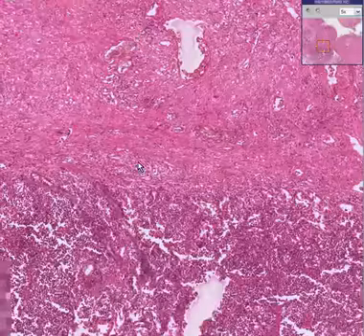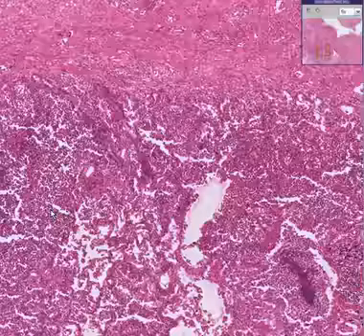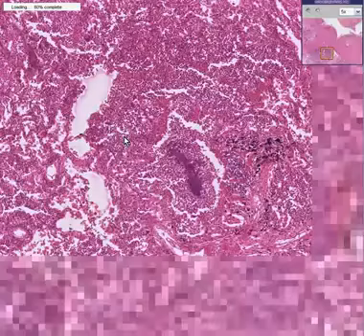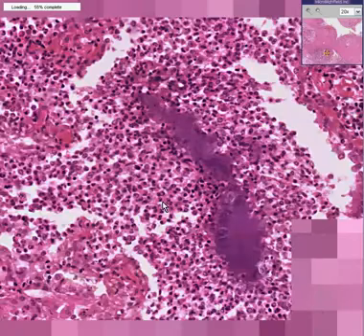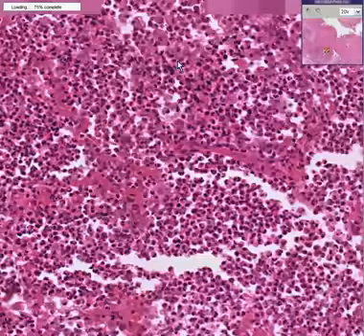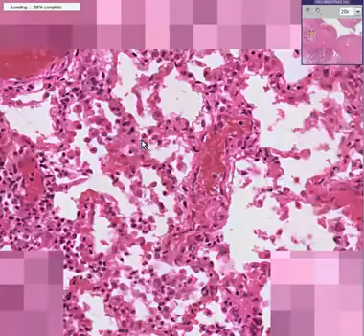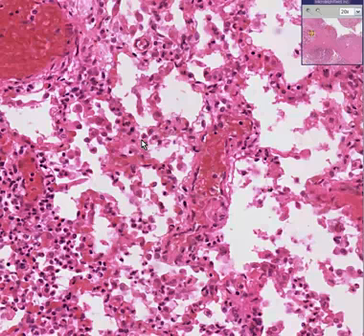What we could recognize down here is that perhaps you could see some outlines of alveoli still, but for the most part you have this entire area filled up with neutrophils, which by definition is an abscess. So these are all neutrophils and fibrin. This is the abscess. Here is the wall of the abscess. And out here is some remnant, very, very congested, possibly edematous lung. This is from a bronchopneumonia.